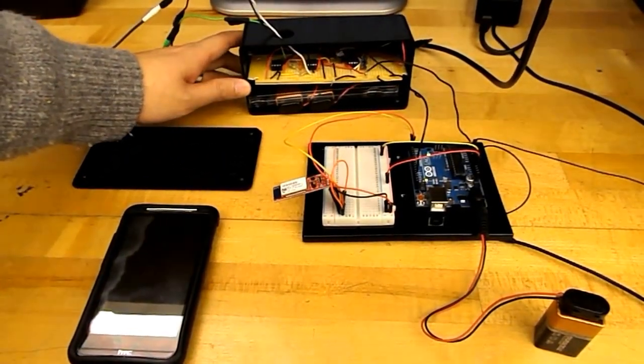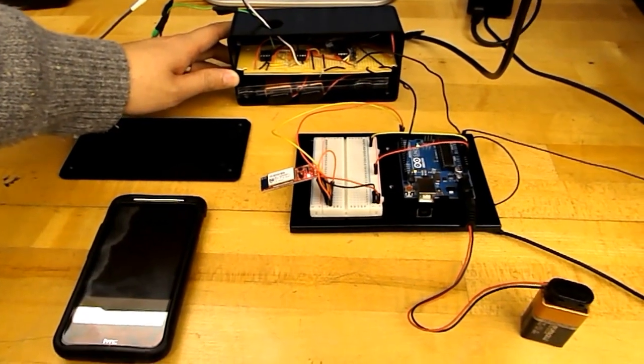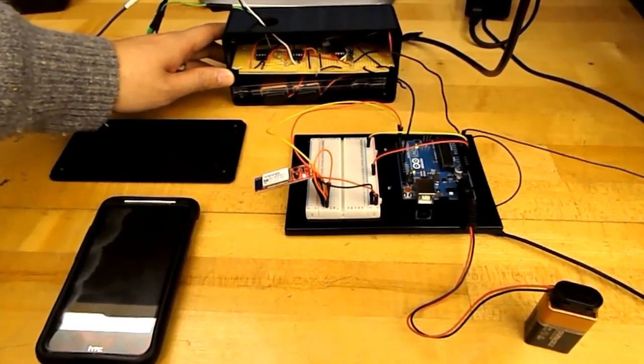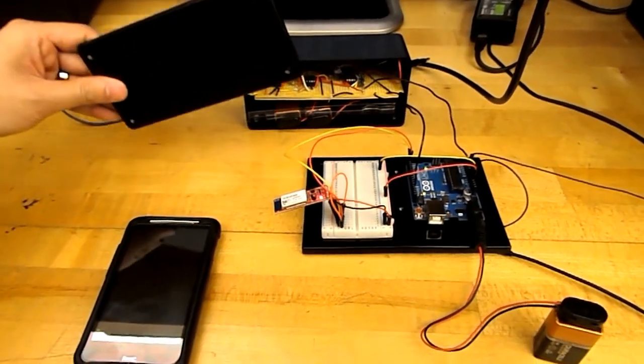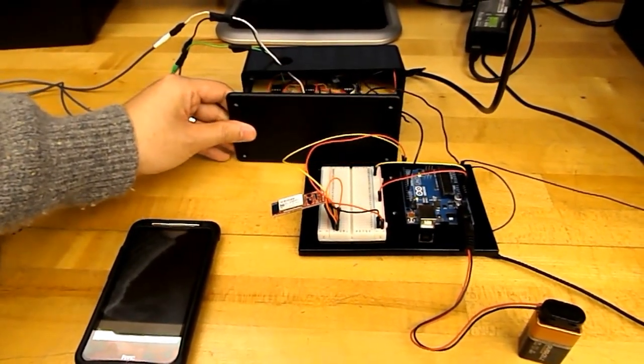This is our portable ECG with wireless monitoring. This is our prototype box. We left it open so you can see the inside of it. This is the original cover of it which would cover it up. It goes on top like this.